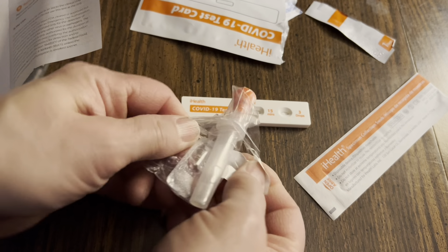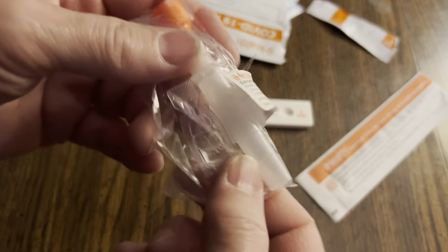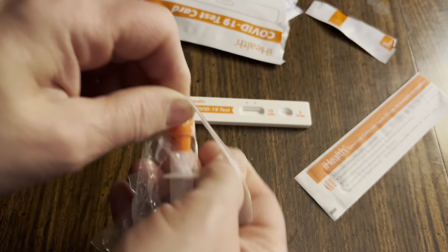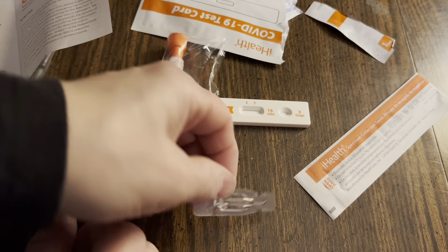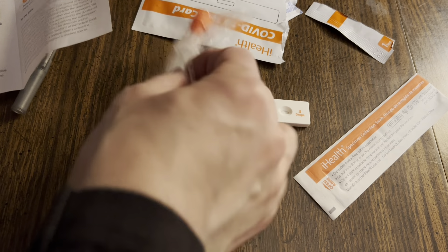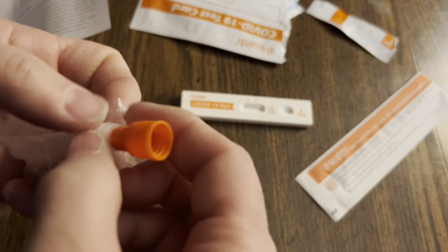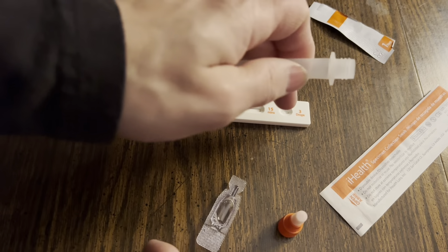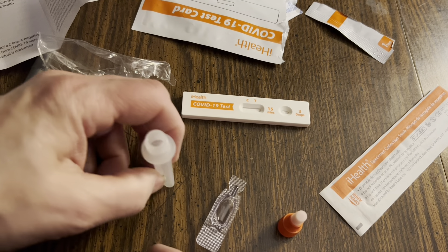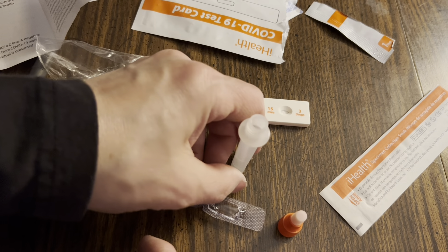And the sealed solution — that's taped on here. So you could get some scissors, or just tear it like that. Get that open. Here's the liquid. There's the empty tube with the stopper on it — it's got a dropper. You're going to use that dropper to drop liquid into the tube.